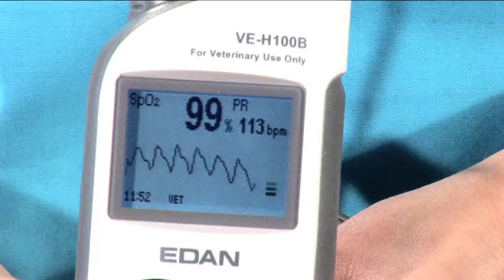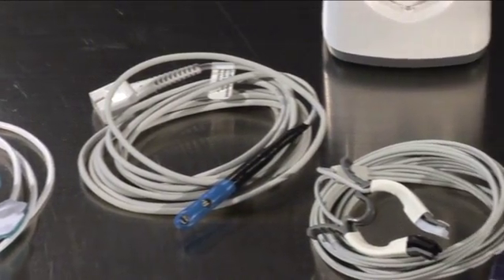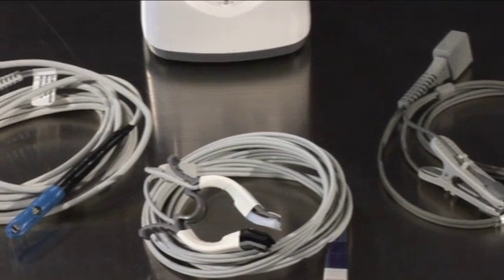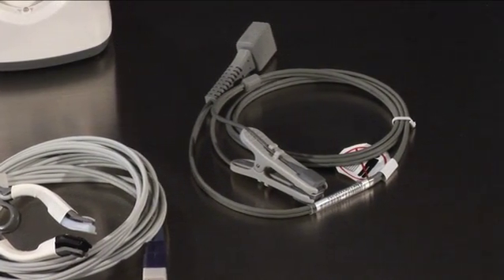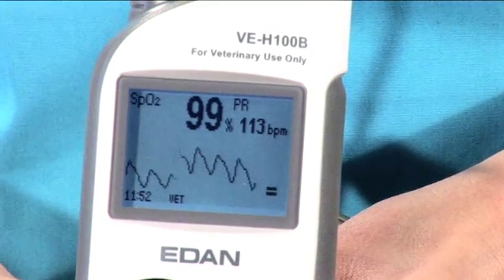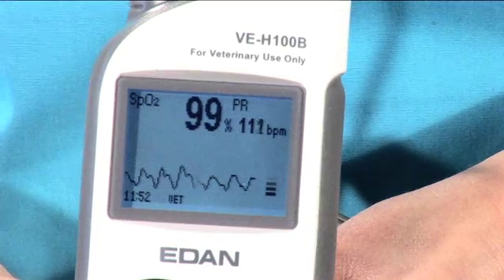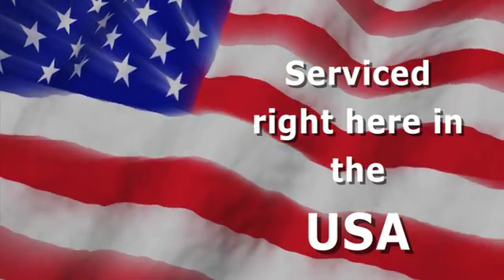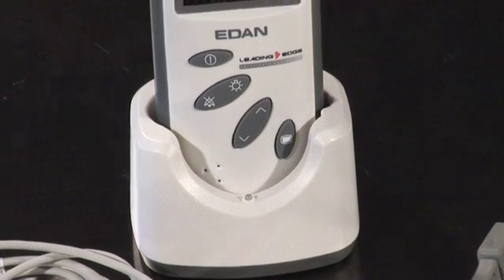If your practice grows and you need more options, the Leading Edge VEH-100B is flexible for upgrading. Keep the same unit and just add on extras as your monitoring requirements grow. We built the VEH-100B to work like a racehorse and hold up like a champ, but should it ever need servicing, we take care of you right here in the USA.